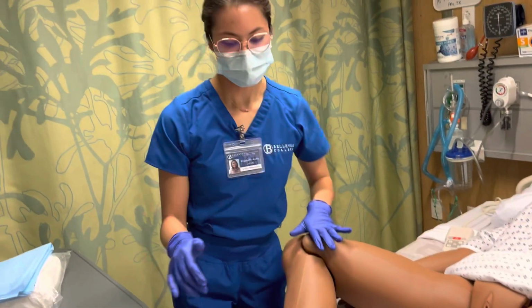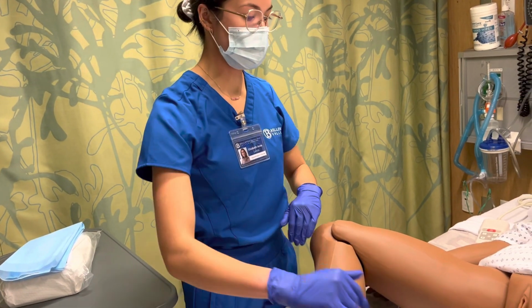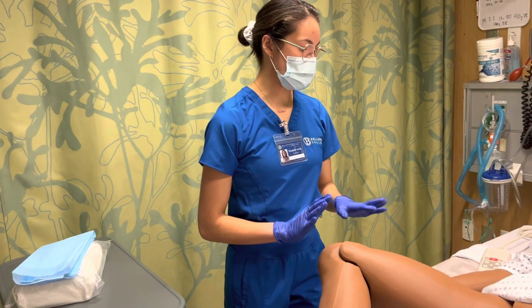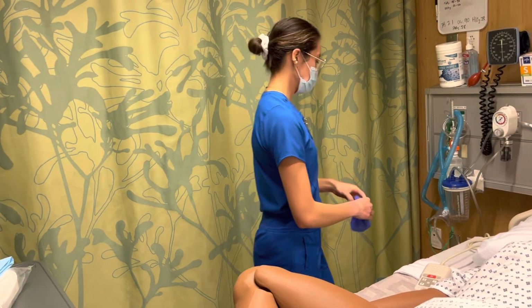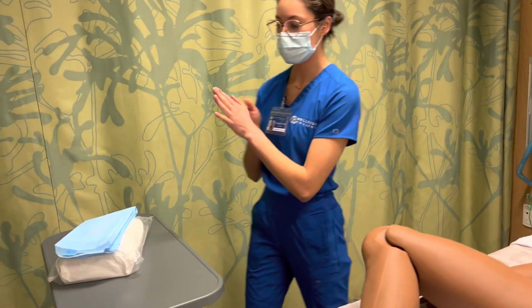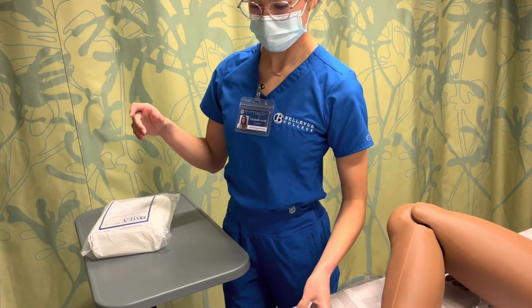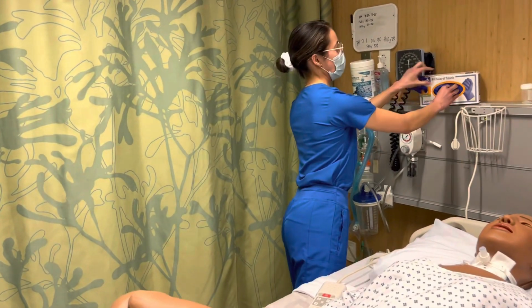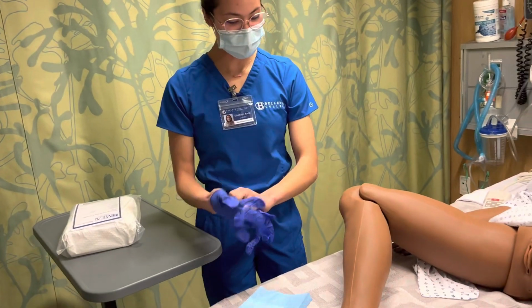Okay. And we could also provide another blanket or towel on the lower extremities just so they're feeling a little more covered. So at this point, peri-care has already been done, so we're going to remove these, and hygiene, and we'll set up our sterile field. I'm going to put clean gloves back on, and we're going to set up this pad so that we can protect our bed sheets and things.